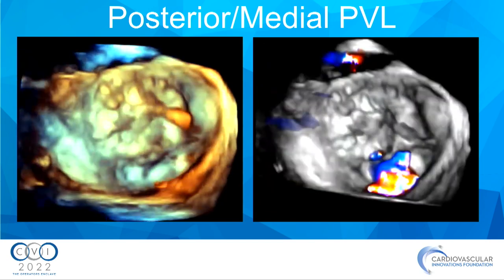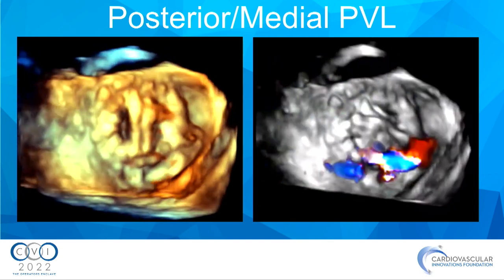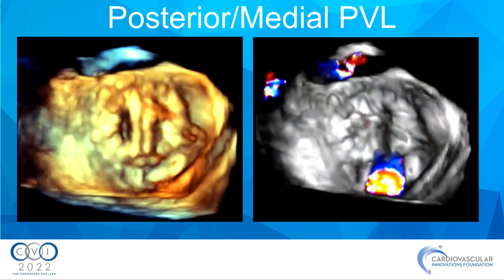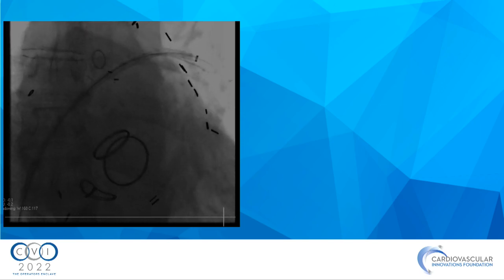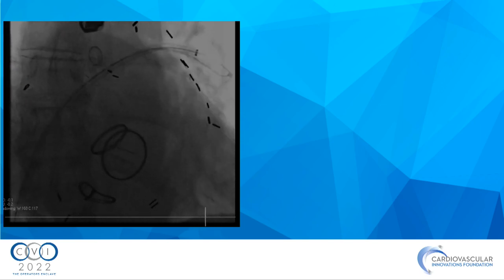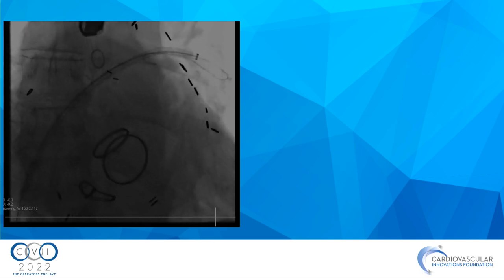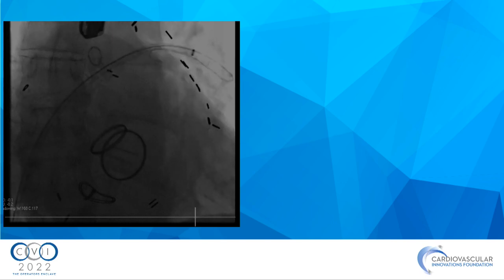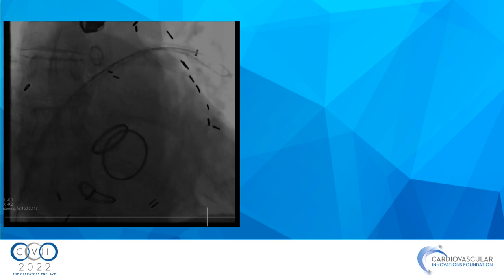It's a posterior medial defect. And as we know, the medial defects tend to pose challenges just from a coaxiality perspective. So we did a standard transseptal puncture. In this case, because it was posterior and medial, we went a little bit higher so that we could angle down and get to the medial defect, and we started off a little central to anterior on the transseptal fossa puncture. And this is us just exchanging out in the left upper pulmonary vein.